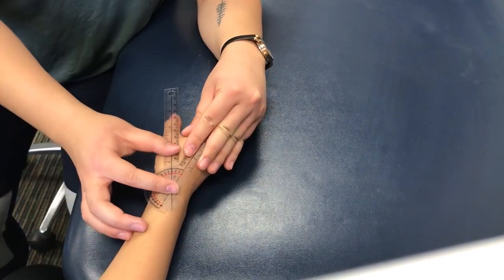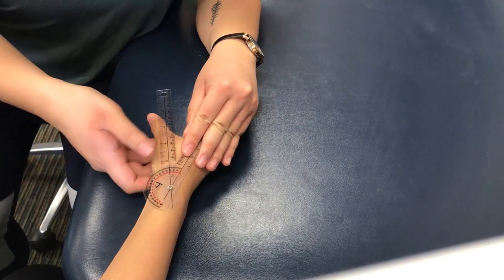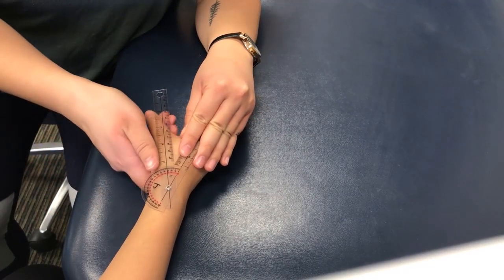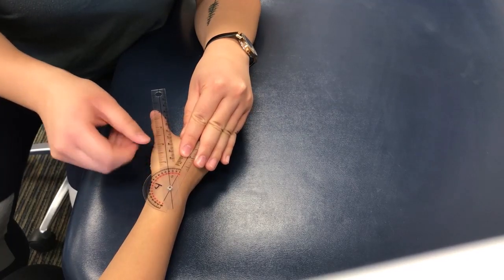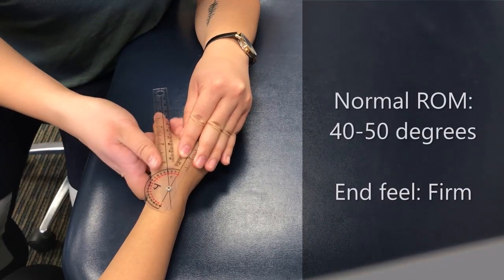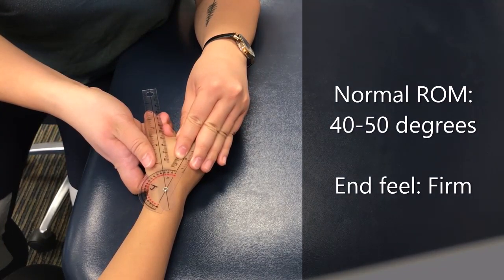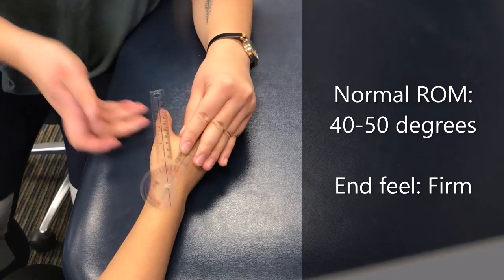Okay. So for active range of motion, you're going to bring your thumb away from your palm. And we're at 30 degrees, and then for passive range of motion, pulling into end range, which is at 34 degrees.